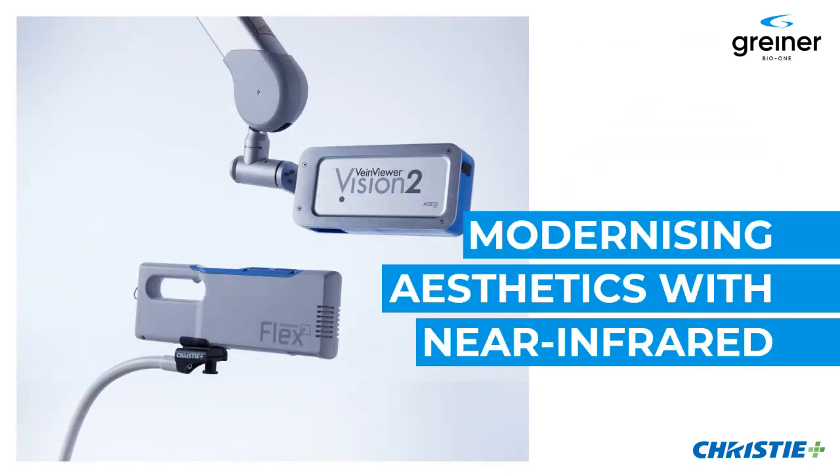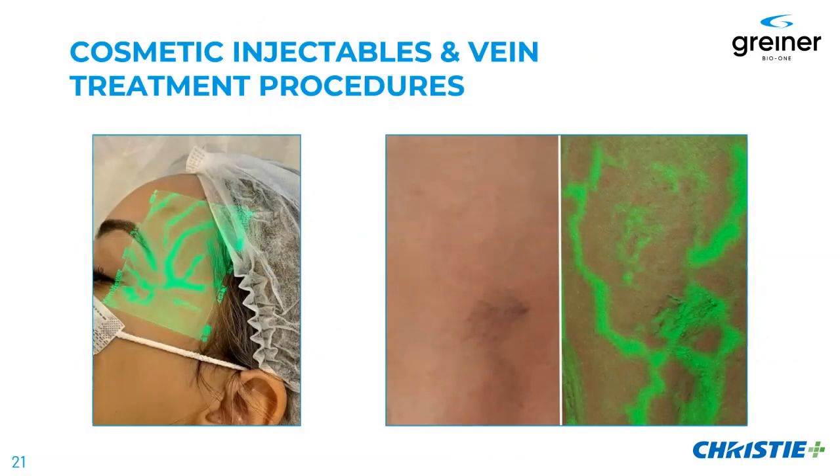So finally, let's move on to modernizing aesthetics using near infrared. Completely different cohort of people. These are cosmetic procedures that people usually come in and they're paying out of pocket for. This typically involves Botox and different types of injectables like hyaluronic acid and so forth, and vein treatment procedures such as sclerotherapy or spider veins in the legs, varicose veins, which can also be quite painful.